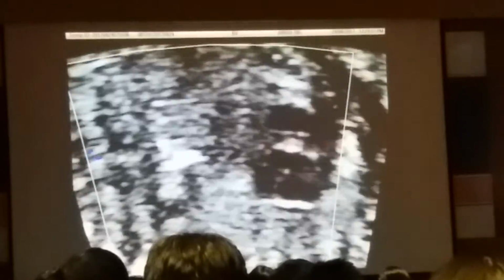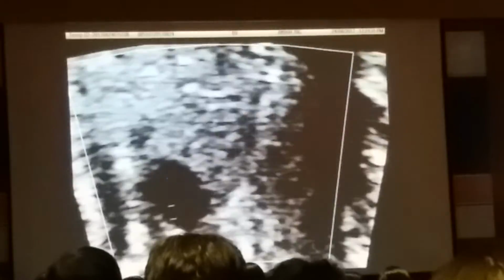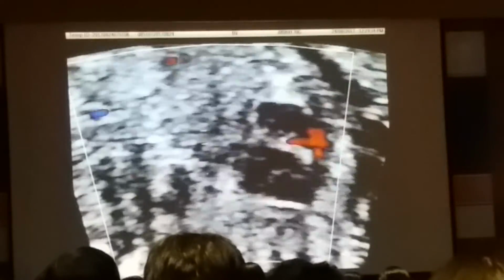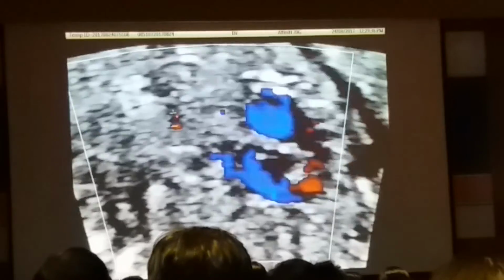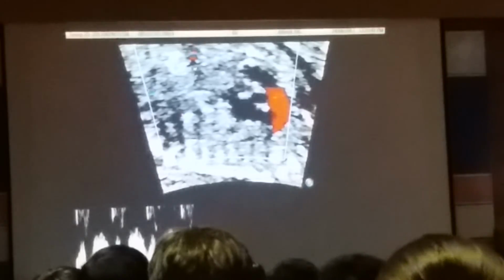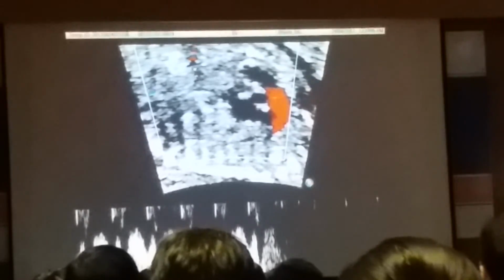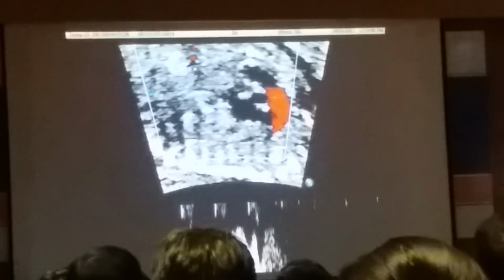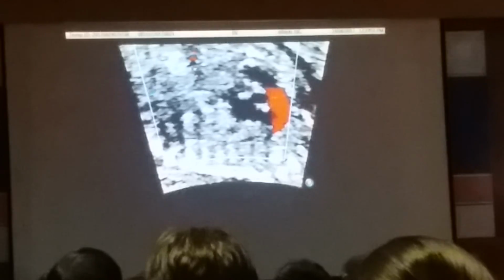Now, where's the Doppler thing quickly? Pulse is there, eh? All right, now. So now that I've bent down and I've looked at what I'm doing, I've lost it there. Okay, now Doppler again. Doppler for me, please. Perfectly normal Doppler. Okay, fine. Very good. Thank you. Well done. Go away. Stay away from doctors. Okay? All right.